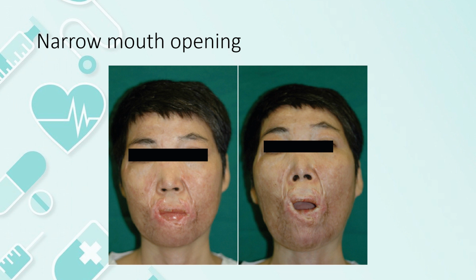In this patient, we can only introduce the blade of the laryngoscope or the endotracheal tube. If we do that, we will not be able to see the view correctly. So what we do is introduce the bougie, so it is easy for us to introduce the endotracheal tube afterwards.